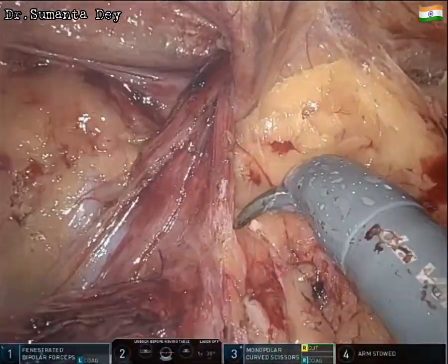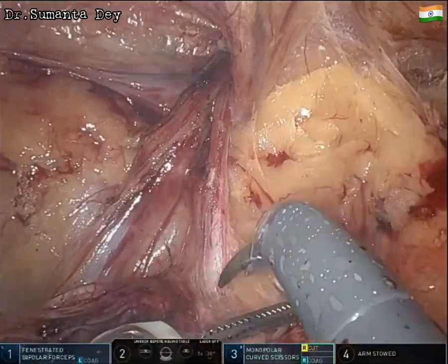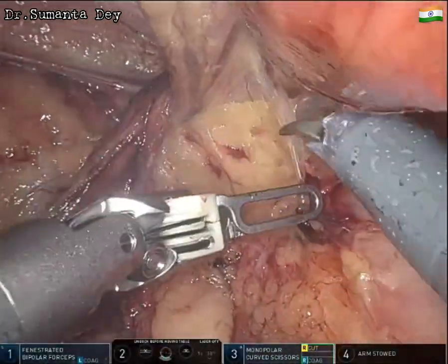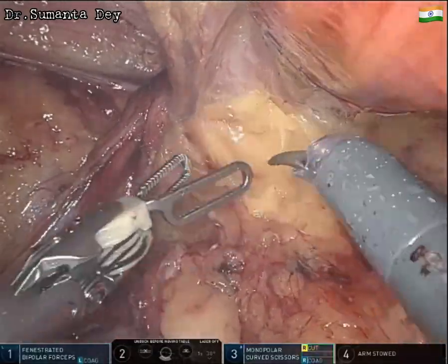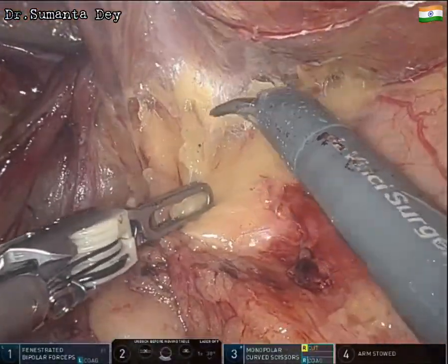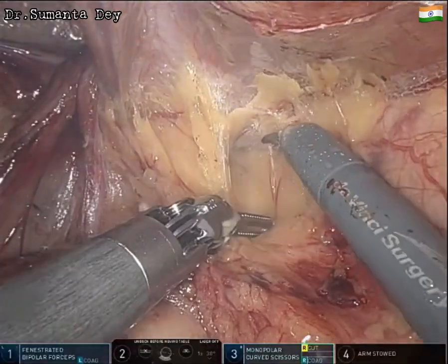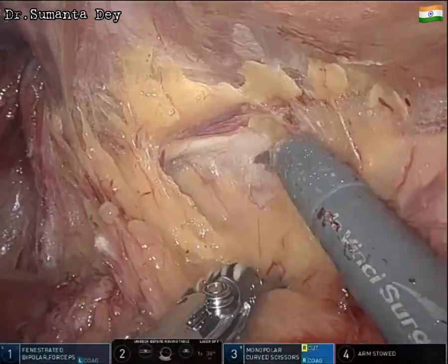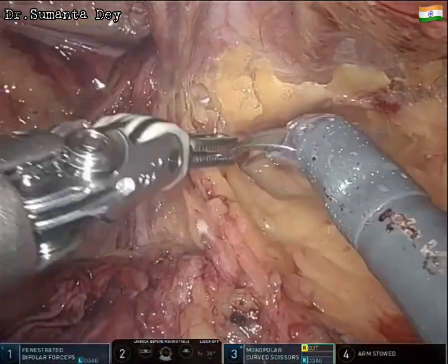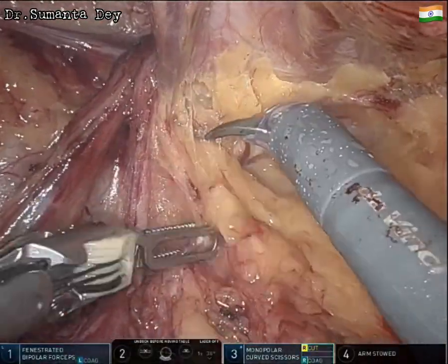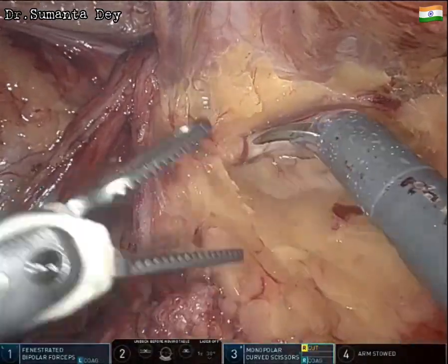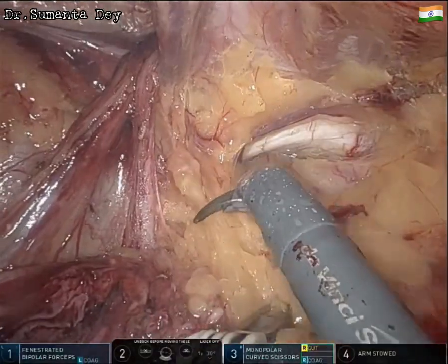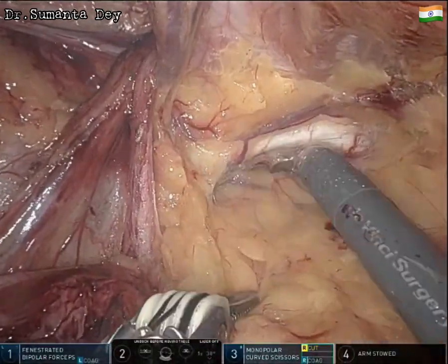Laterally, the iliopubic tract, gonadal vessels, and peritoneal reflection form the triangle of pain where the nerves are located. Parietalization of at least five to six centimeters from the defect margin is performed downward. The Cooper's ligament is getting exposed, and all preperitoneal fat at the indirect hernia site is dissected and reduced.